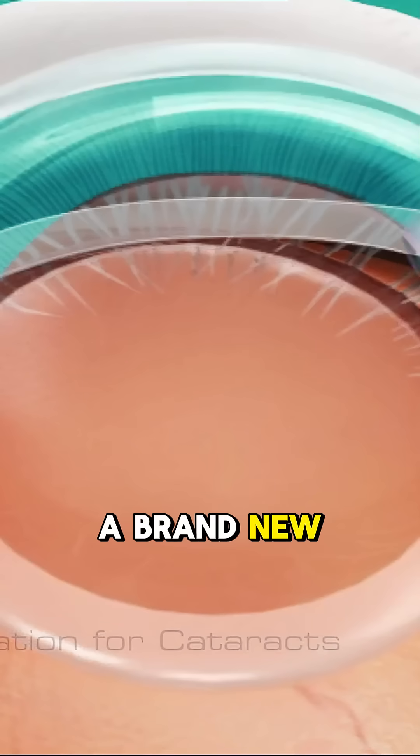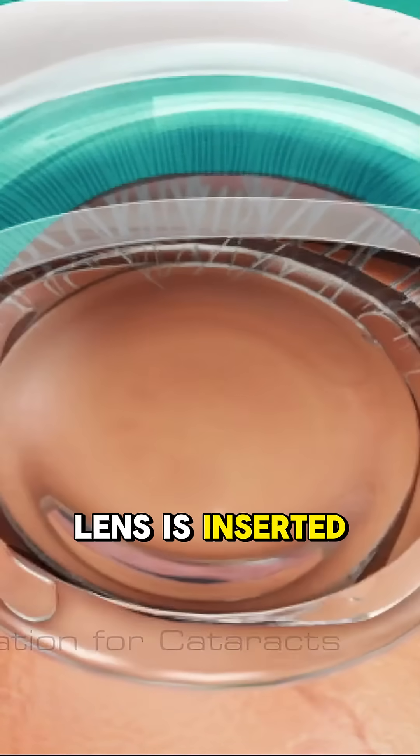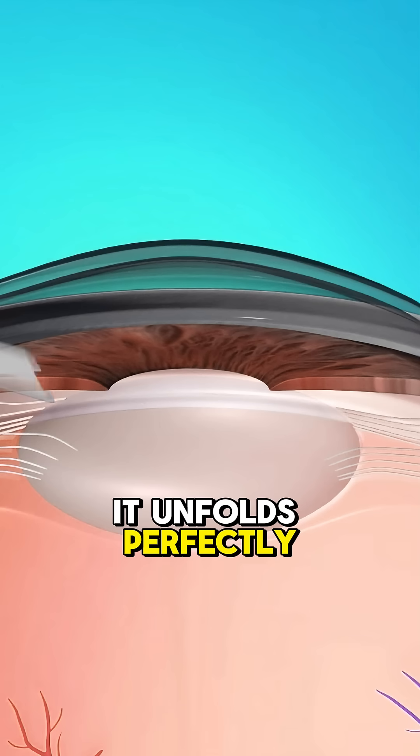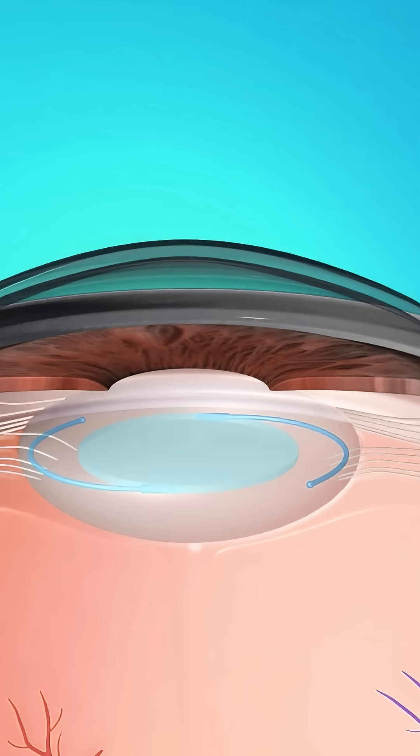And finally, a brand new artificial lens, called an intraocular lens, is inserted. It unfolds perfectly inside your eye, replacing the old cloudy one.